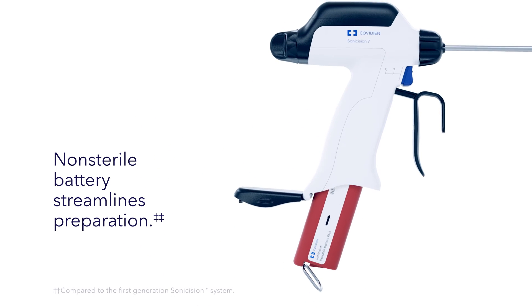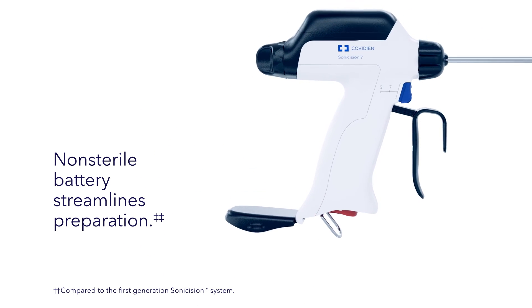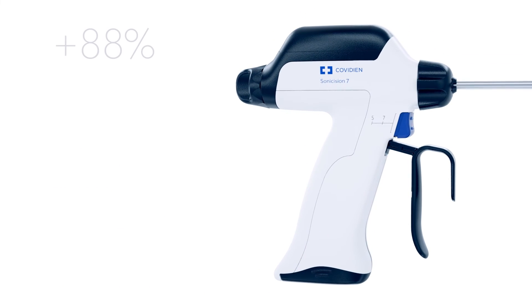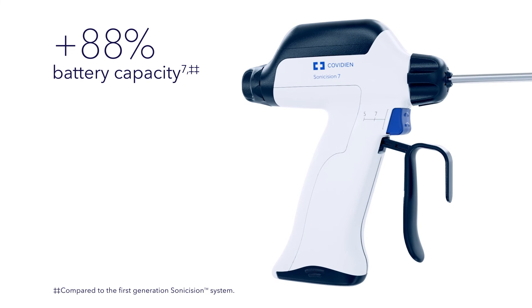The non-sterile nature of the battery removes the need for sterilization and streamlines preparation for reuse, providing an 88% increase in battery capacity.